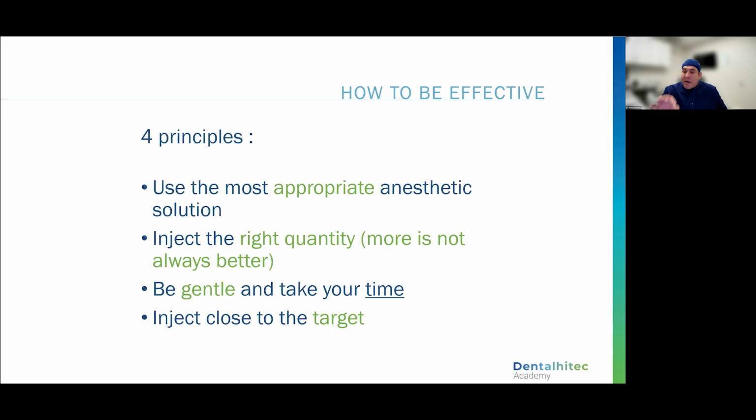And when it comes to time, here's an important concept, because we have had some people say, well, this takes me longer to do, to give the whole injection from step 1 to step 3. I promise you that if you really looked at your time from giving a block appropriately, not just putting the needle in and pushing as fast as you can, but if you give a block at, let's call it, a milliliter a minute, and then you waited for that local anesthesia to take effect, it's the same amount of time.